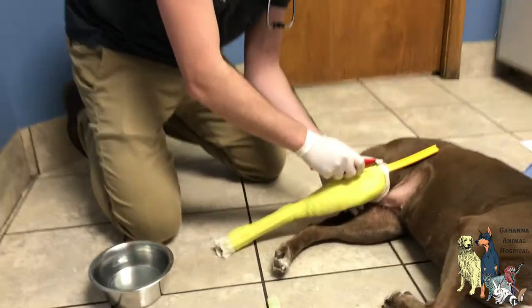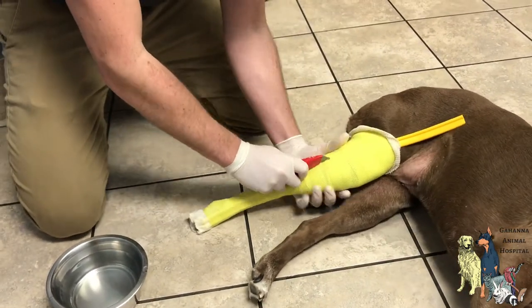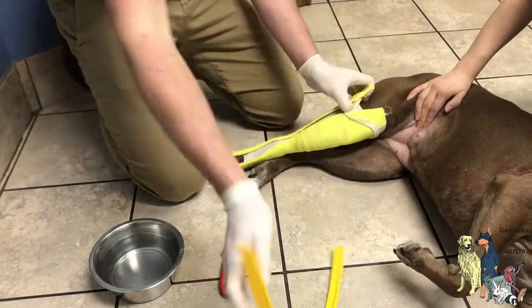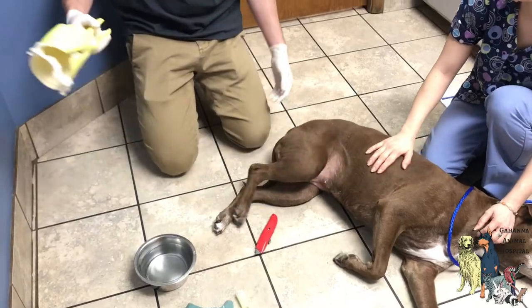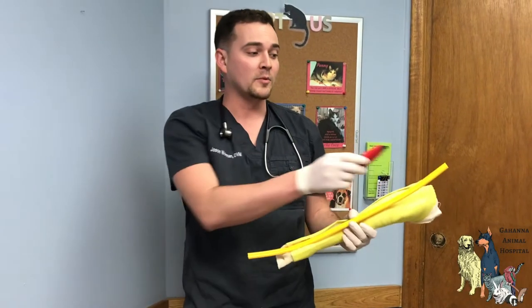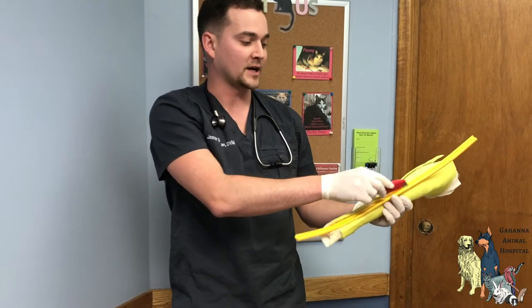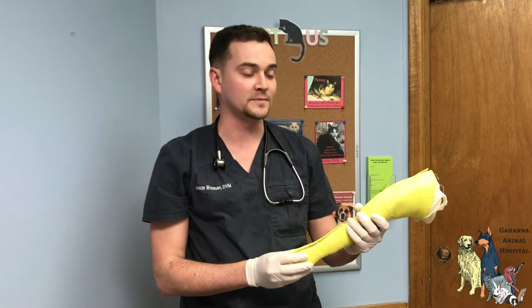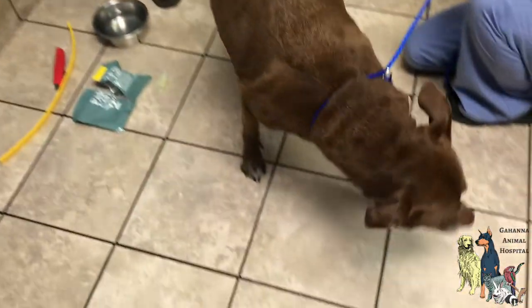Now it's time to get Georgia out of this cast. Good as new. This yellow rubber piece was designed so we could safely cut down to get Georgia out of her cast. And now we send this cast to Hero where they will formulate a custom knee brace to fit. Stay tuned, there's more to come.